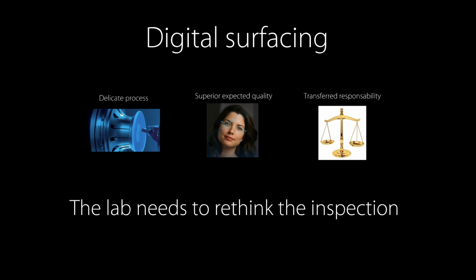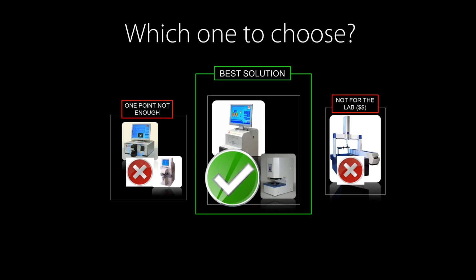It actually moved from mass production to RX. And we've seen that among the available solutions, the mapping inspection is more appropriate for the lab compared to the lens meter, which is not appropriate to assess the design replication, and the XYZ table, which has a high cost in price and maintenance.